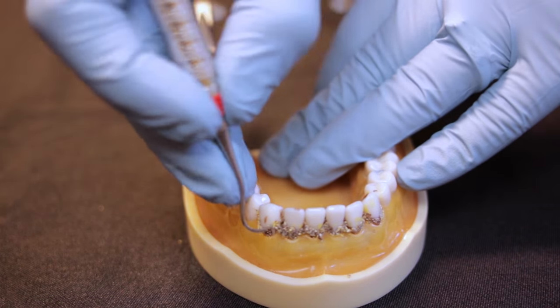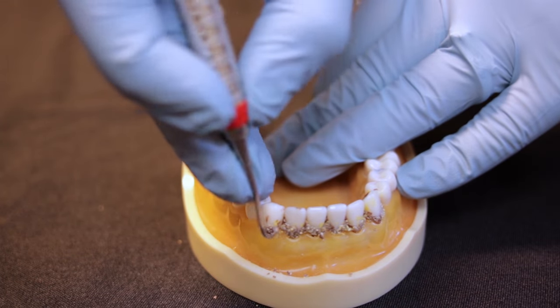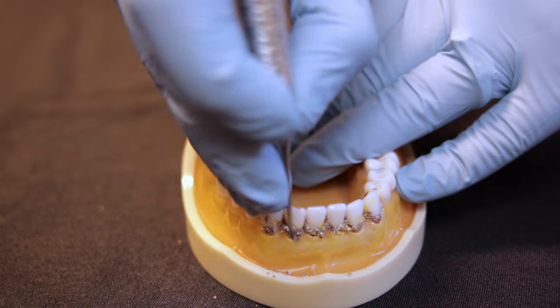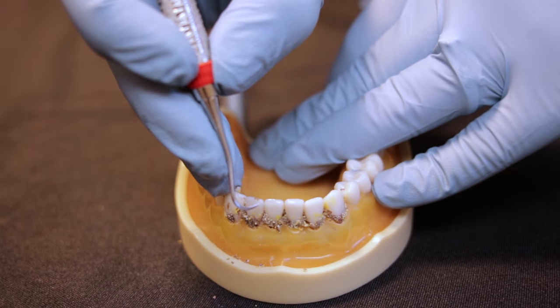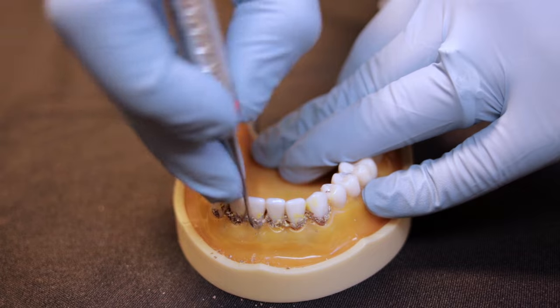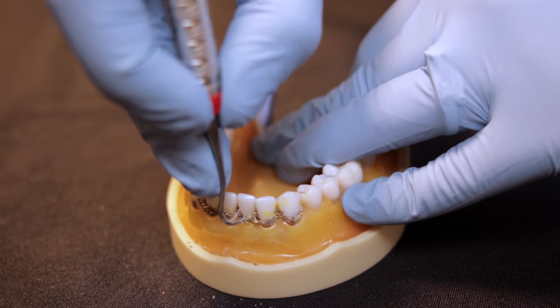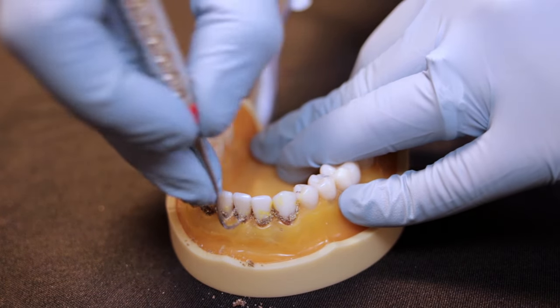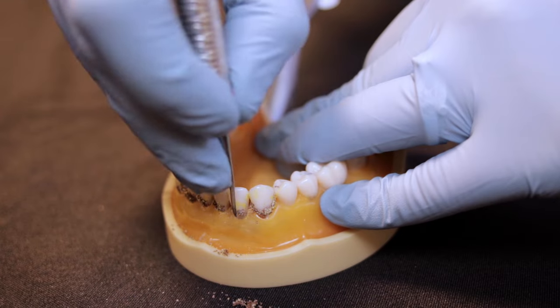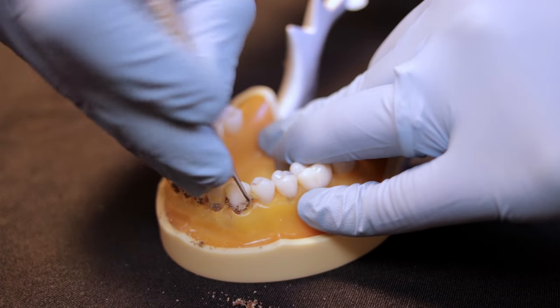Now we're going to go on to the facial and stay in the same chair position, doing the surfaces away with the same instrument. We're getting interproximal and scaling all the way up to the contact. Notice how I'm doing several strokes at once, rocking on my fulcrum. Students sometimes slow down and do one stroke at a time, but when dealing with this much calculus you want to do four or five strokes right after another, using your fulcrum to rock.